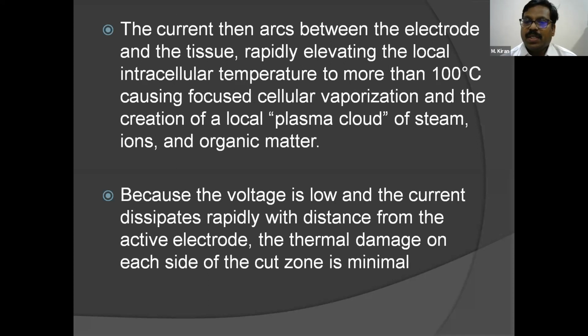Because the voltage is low and the current dissipates rapidly with distance from the active electrode, the thermal damage on each side of the cut zone is minimal.